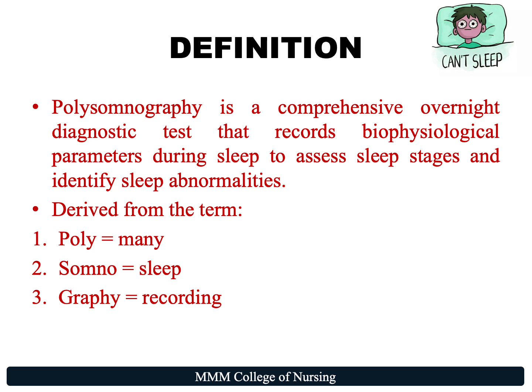Polysomnography is defined as a comprehensive overnight diagnostic test that records biophysiological parameters during sleep to assess sleep stages and identify sleep abnormalities. This is derived from the term poly, which means many, somno, which refers to sleep, and graphy, recording.